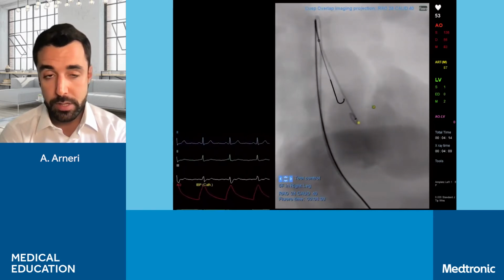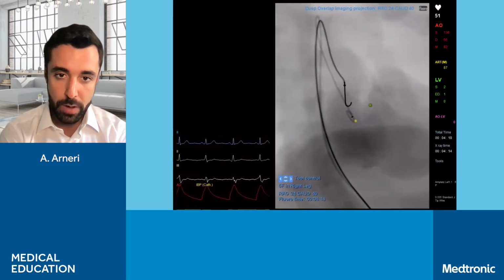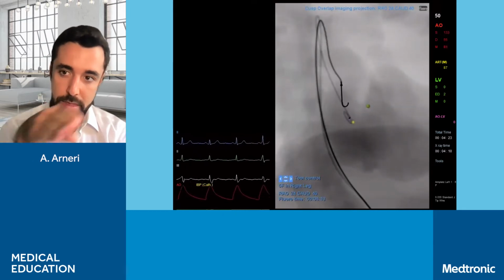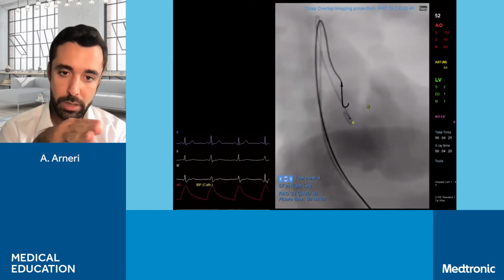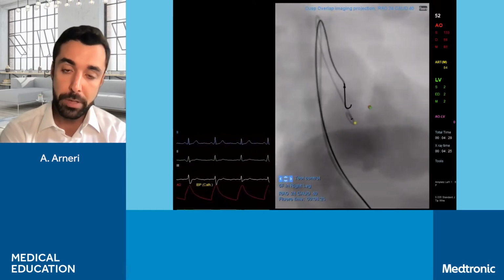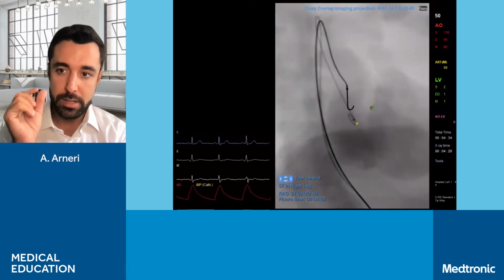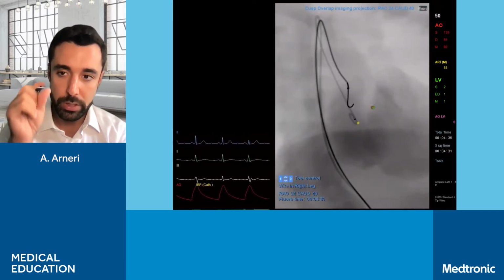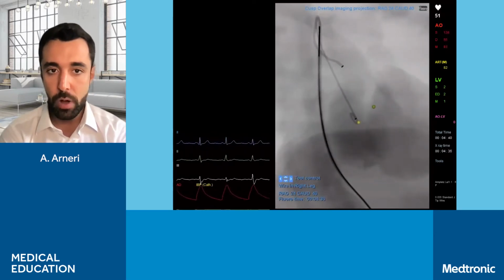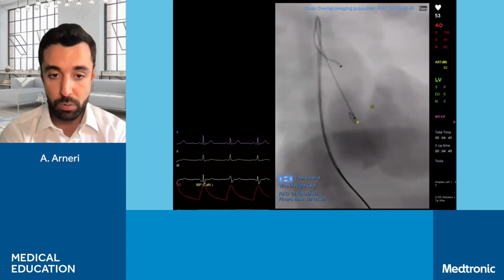I suggest to do the crossing in this projection because here you have to basically point your AL1 tip toward the center between the yellow and the green-red dots. But to do that, you need a straight tip wire because this is aortic stenosis, so the hole is really small and you need a straight tip wire to go into that hole. So we're going to remove now the J wire, which is a J tip, so it's not possible to use that to cross the valve.